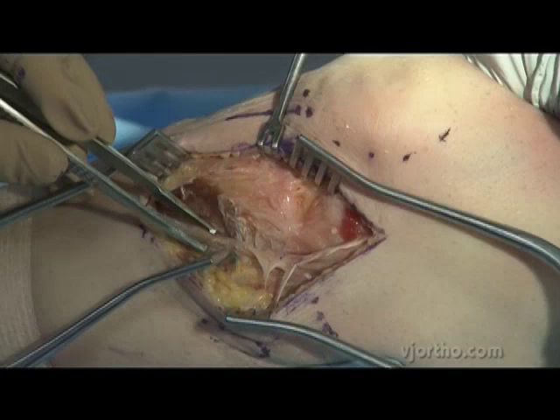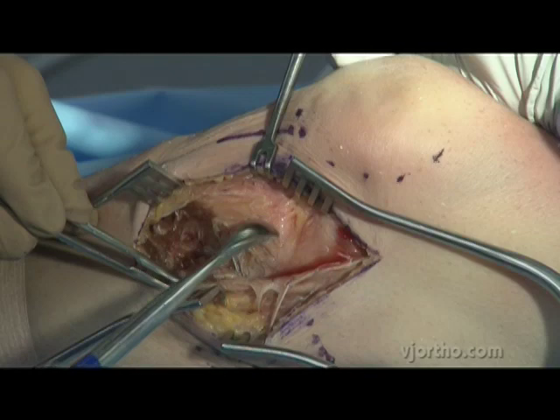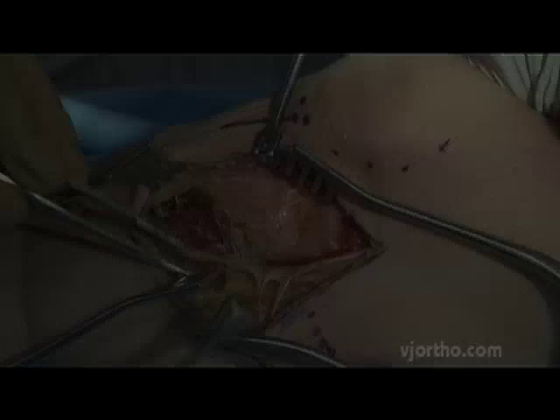The fibular head is right here, and this is the proximal tibial fibular joint right at this interval. The plate typically has a posterior extension down to this level to capture the posterior part of the joint.